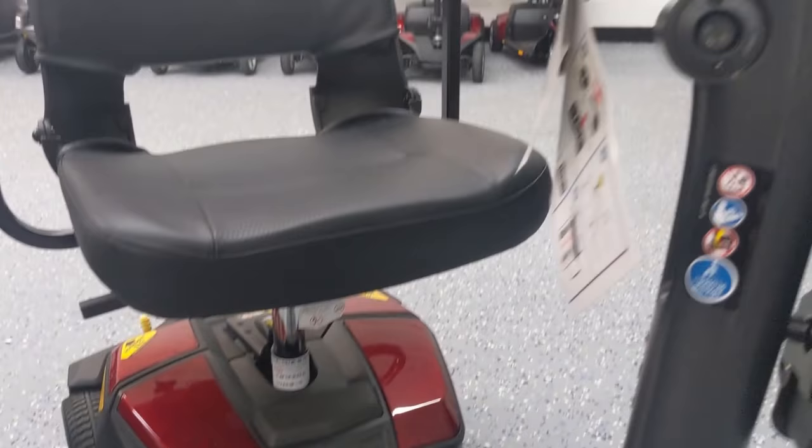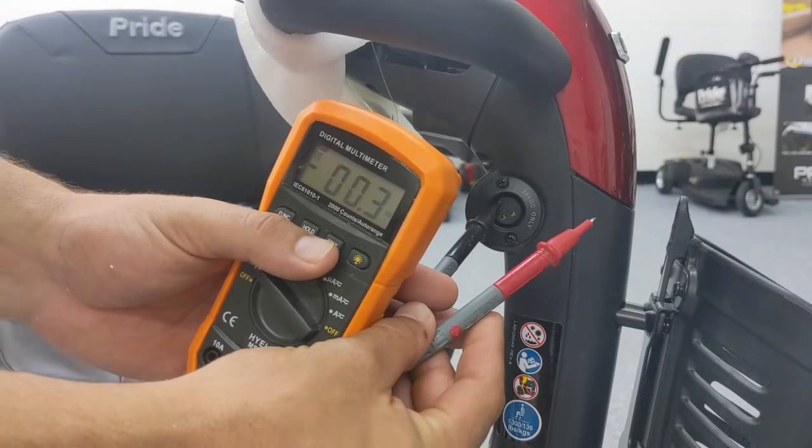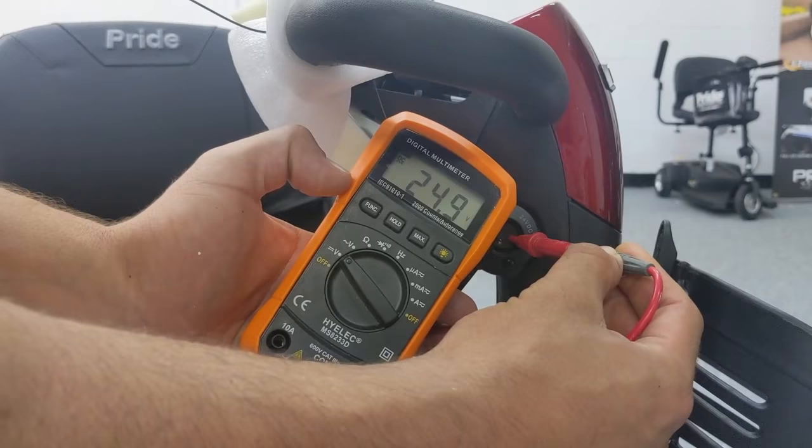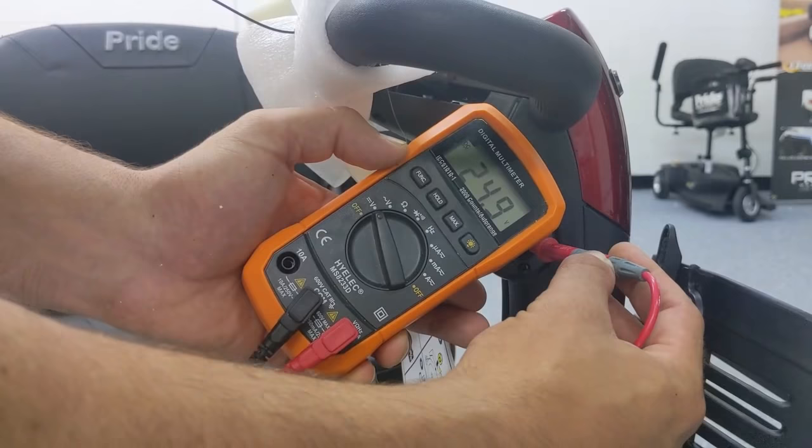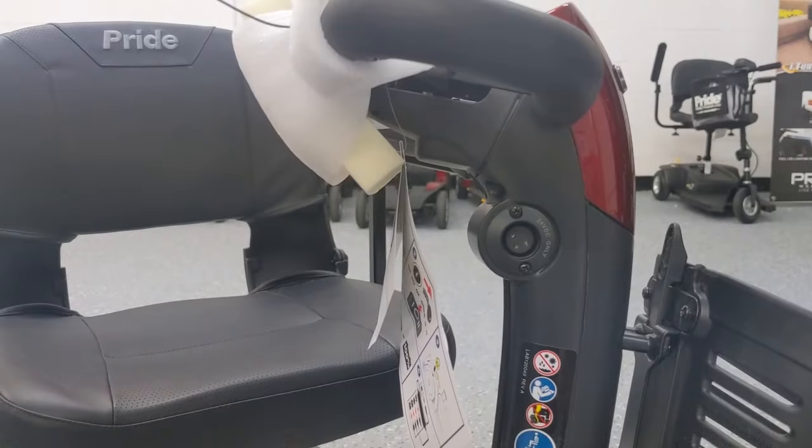For this test, we're going to be testing the actual voltage of the batteries by putting our black and red probes on the left and right holes of the charger port. As you can see, we have 25 volts roughly, which is pretty much a full charge. Two 12-volt batteries fully charged will actually give you about 25 volts.